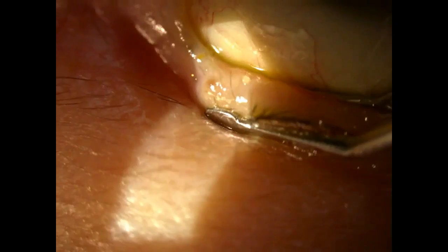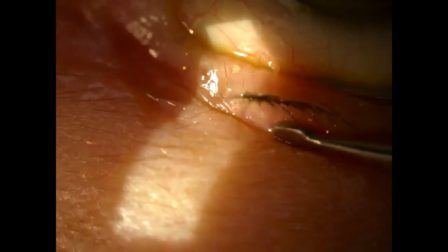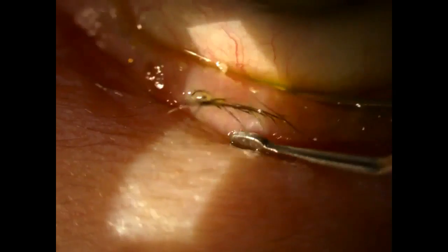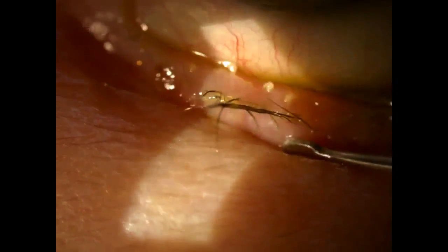Just apply some general pressure — as you can see, the meibomian glands express fairly easily with this pressure. You can simply keep it in one place, or you can actually try and work the contents out by starting a little bit lower on the lid and working your way to the more distal end of the gland, so to speak.